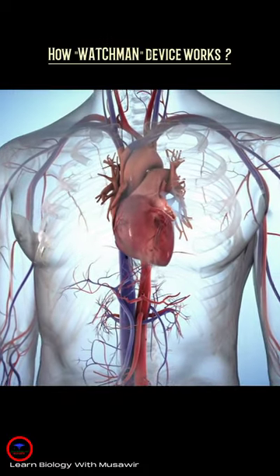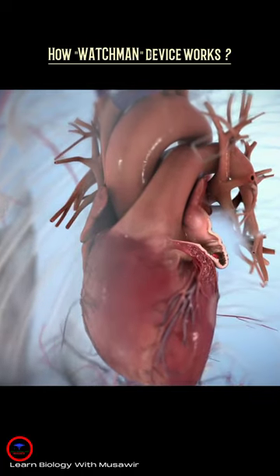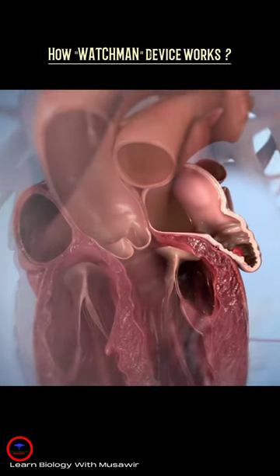In patients with non-valvular AF, over 90% of stroke-causing clots that come from the heart originate in the left atrial appendage, or LAA.